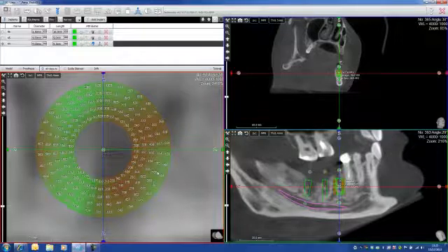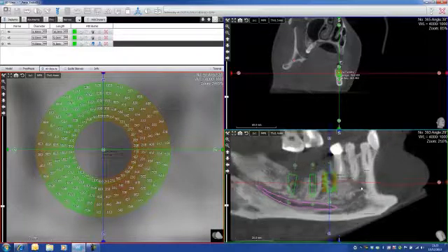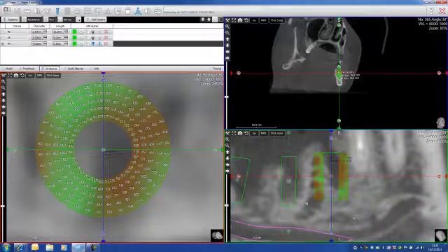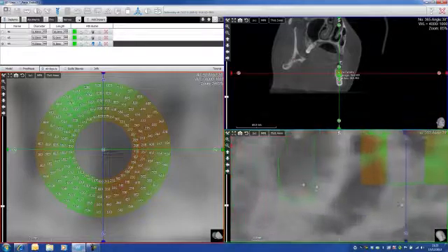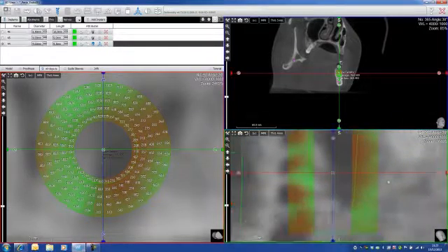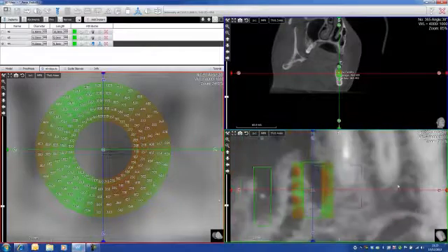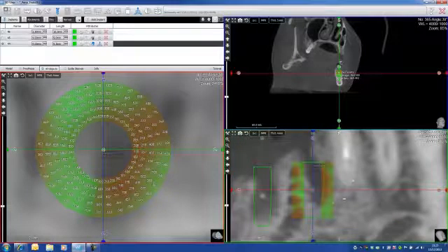And of course, these values are showing up also on the sagittal view here. When it's red, it means that it's not sufficient enough. When it's green, it means that it's okay.